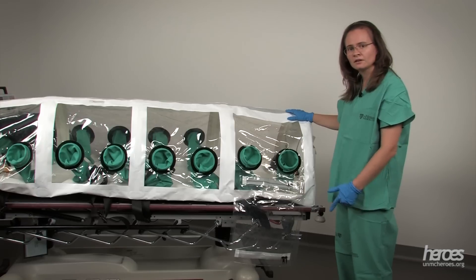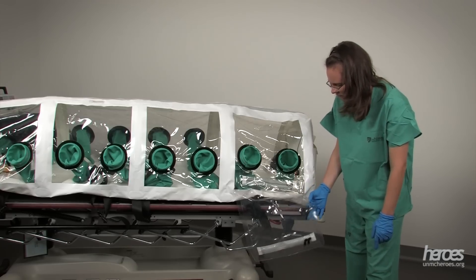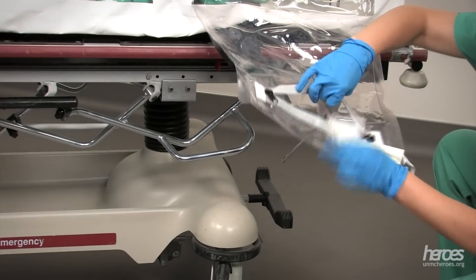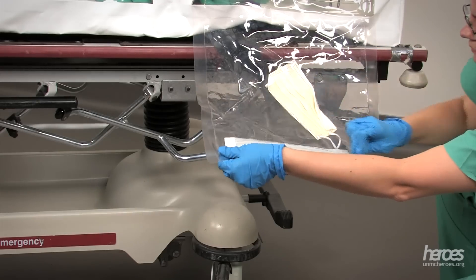Your isopod may have another access port. In this case, the access port is clear and includes zippers. We can insert our item into this clear compartment through the zipper and shut it, and then the care team can access it through a secondary zipper inside and bring it into the isopod.